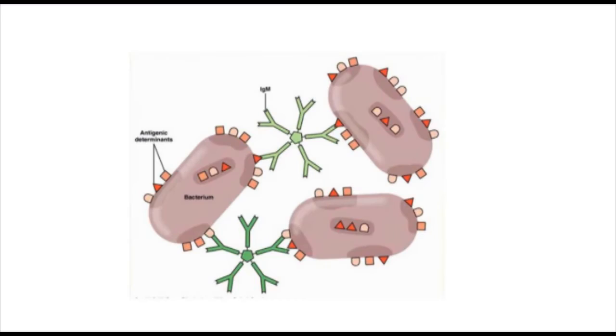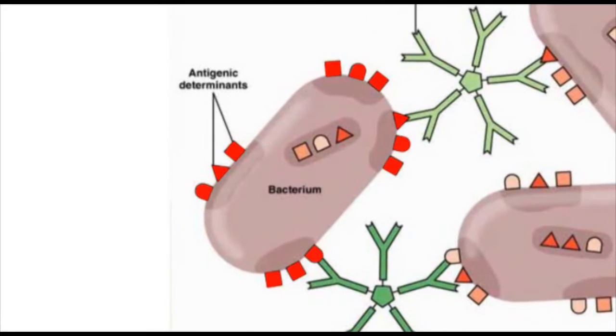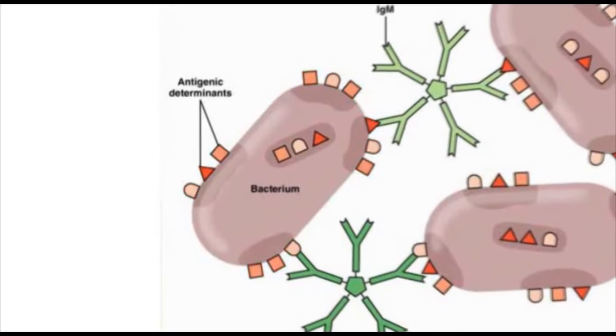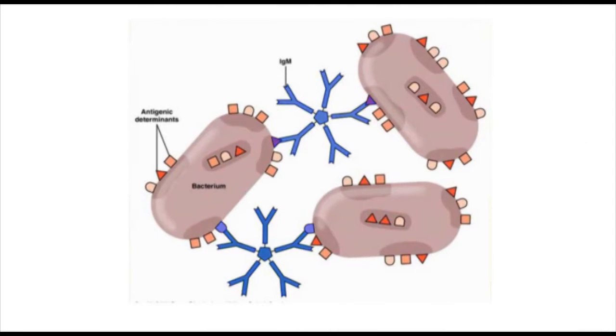The antigen involved in agglutination reactions could be surface antigens present on erythrocytes, bacterial particles, or antigens attached to some matrix. These particulates and cells involved in agglutination reactions should have multiple binding sites to form crosslinks, which results in clumping.